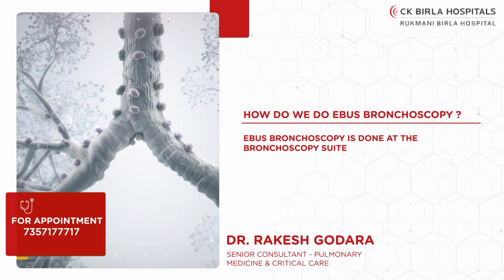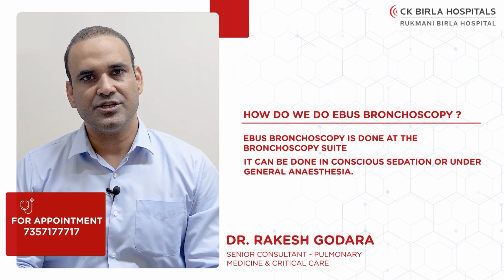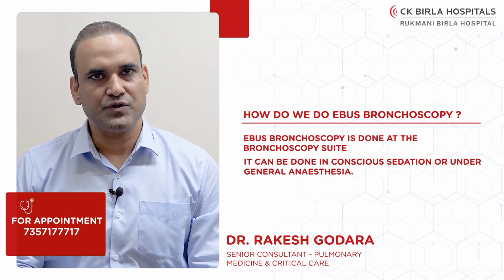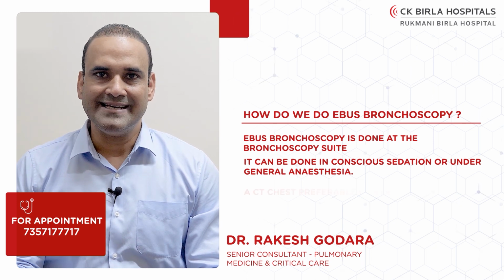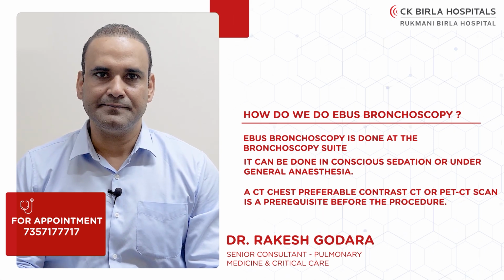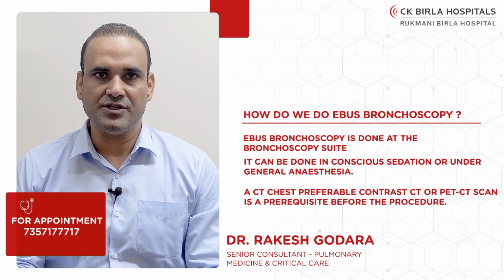EBUS bronchoscopy is done in the bronchoscopy suite. It can be done under conscious sedation or under general anesthesia, depending upon the patient's profile, comorbidities and the need for the procedure. The patient has to fast overnight for a next-day morning procedure. Generally, the doctor goes through a checklist before the procedure. A CT chest or PET scan is a prerequisite before the procedure. Contrast CT is more preferable. CT chest helps to note down the abnormal lymph nodes, their size, location, character and any abnormal lesion before starting the procedure.